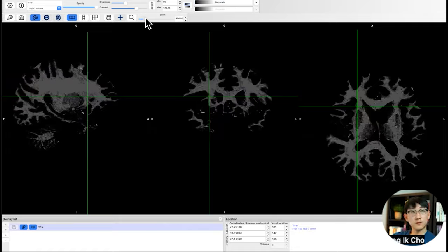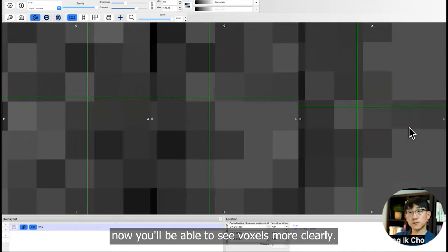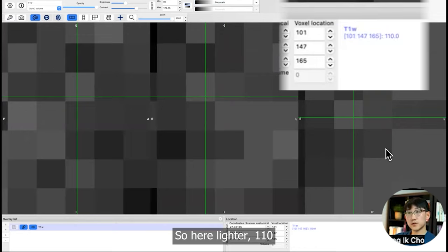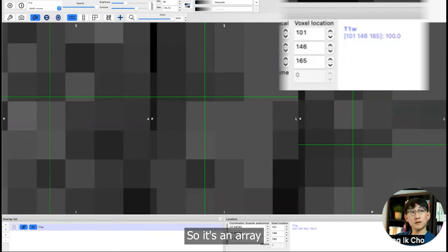You can also zoom in to a region. Now you will be able to see voxels more clearly. So here lighter: 110. Here darker: 100. It's an array. As long as you understand this is an array, that's good for today.